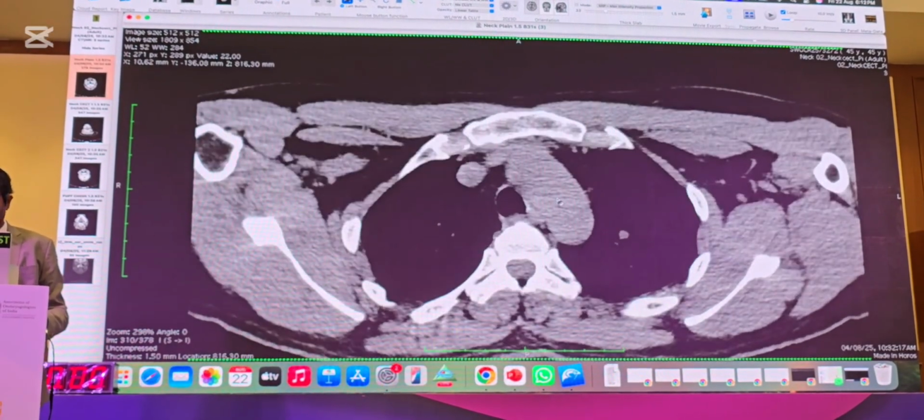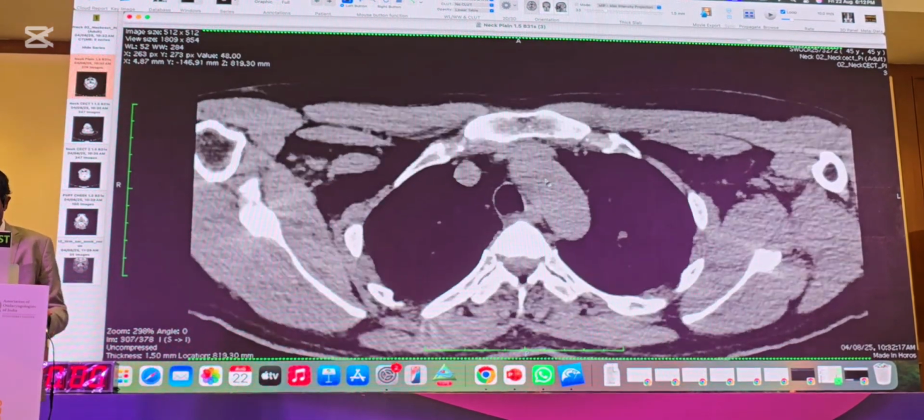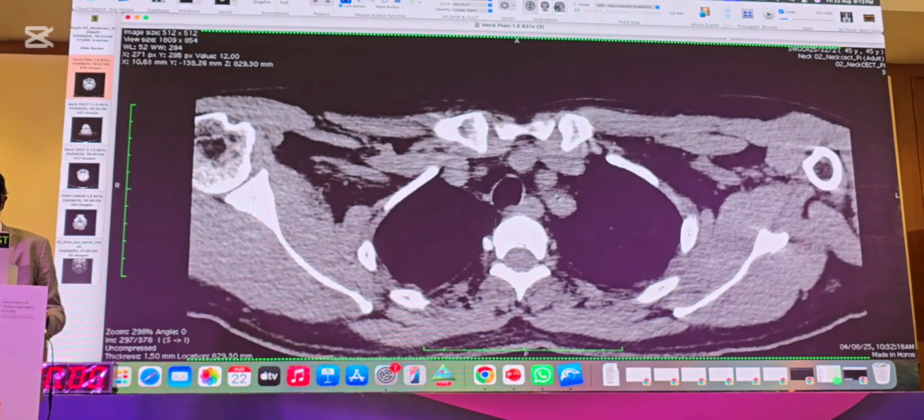So when you come out, just now we will finish up the vascular compartment. When you come out, you are able to appreciate three structures, three dots, 1, 2, 3.